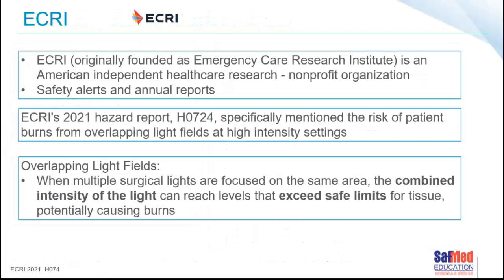So some of you may be familiar with the ECRI Institute, and ECRI was originally founded under the name of Emergency Care Research Institute. It's in fact an American independent healthcare research non-profit organization. ECRI release a whole bunch of safety alerts and annual reports, which are quite interesting to read yearly. Often we find flexible endoscopes in there and all sorts of hazards that they refer to in our operating rooms and our CSSD environments.